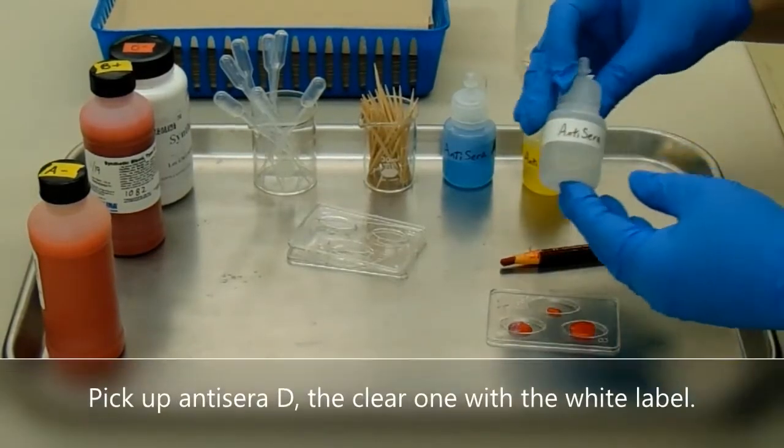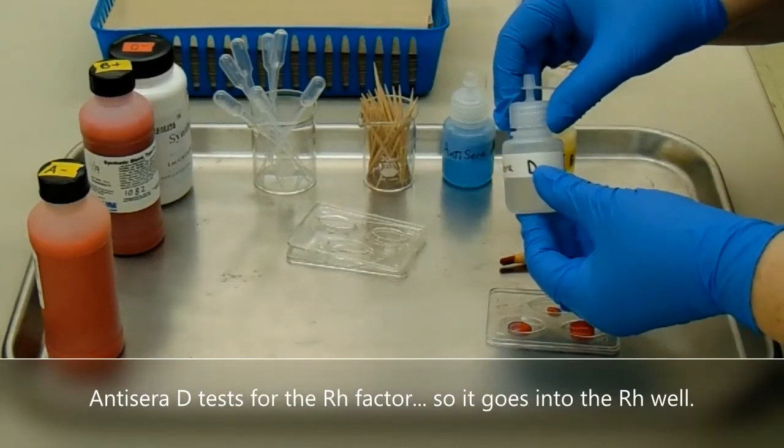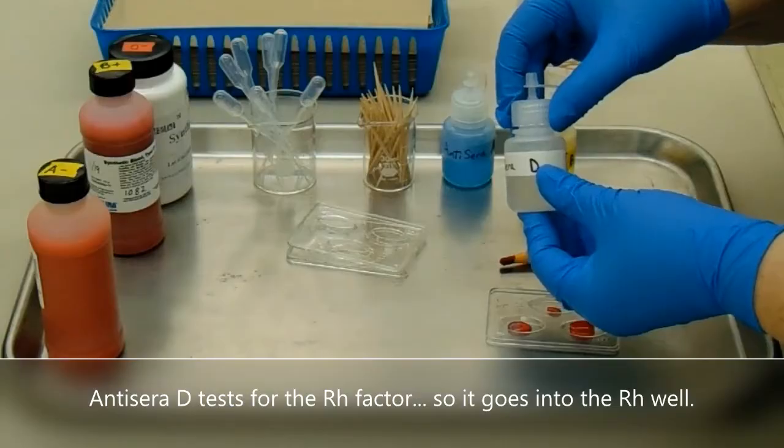Pick up antisera D, the clear one with the white label. Antisera D tests for the RH factor, so it goes into the RH well.